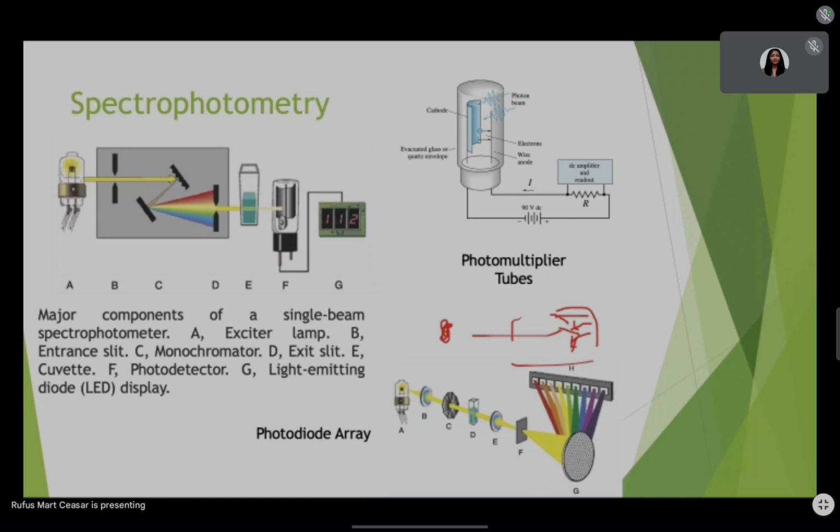selected wavelengths lang yung maano natin. Ito, nasa-select niya na yung simultaneous na wavelength. So, sobrang bilis ng analysis. Kailangan sa hospital kasi minsan madaming backlogs, ganun. Meron na-select niya na yung various wavelengths. Compared dito, na selected wavelength lang. Kung ano lang yung sinelect mo, yun lang yung i-read niya. Ito, na-read niya na yung various wavelengths. Ayan. So, yun yung basically.